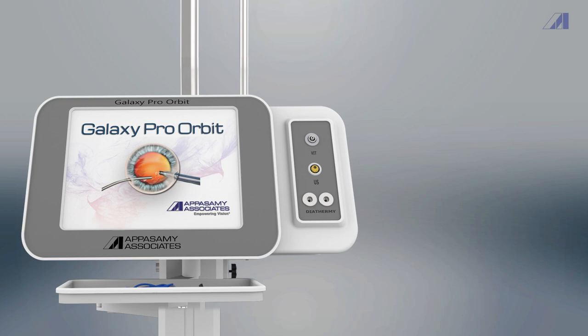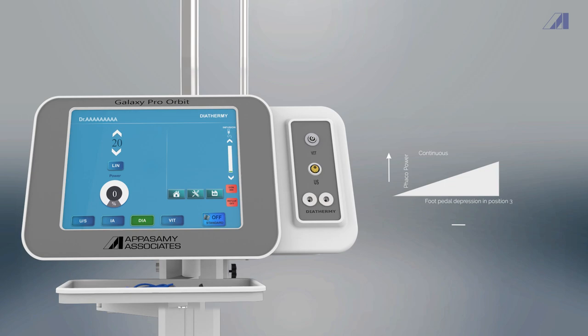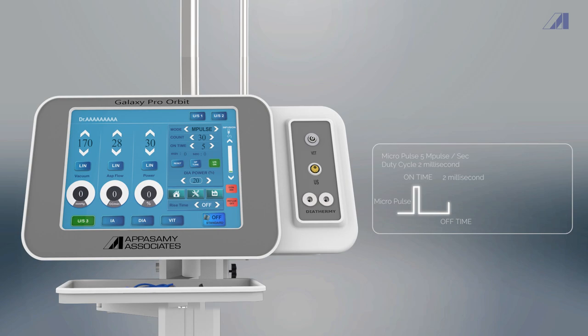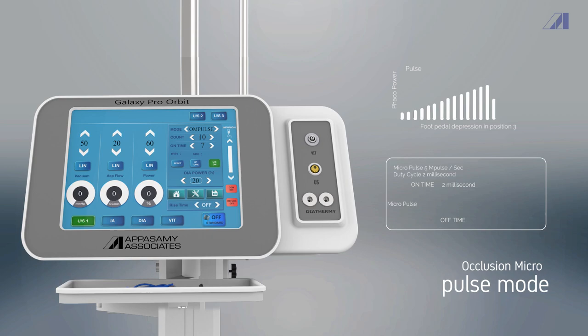The Galaxy Pro Orbit is designed with seven different phaco modes in which Micro pulse or cold phaco mode is considered most advantageous as it allows the user to customize the on time duration as per their requirement and provides crystal clear cornea without any wound burn. This mode maintains temperature at a lower level even when the surgeon works with a higher grade of cataract.